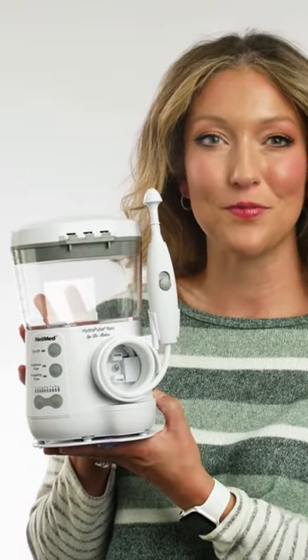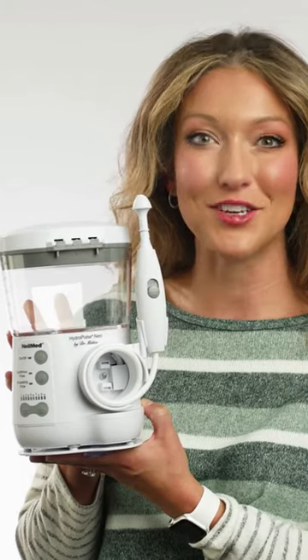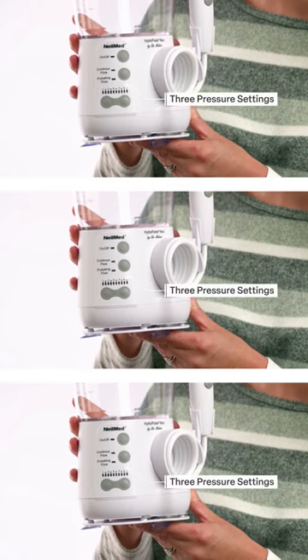The NealMed HydroPulse Neo is a multi-speed pulsating nasal wash designed to provide all natural sinus relief. With three different pressure settings, you can quickly alleviate allergies or congestion.